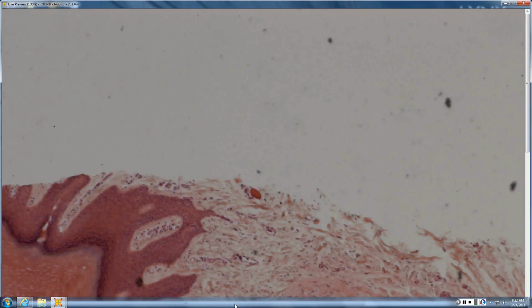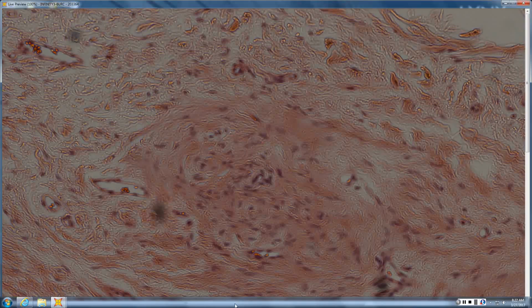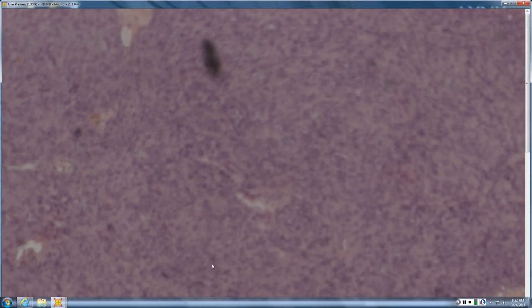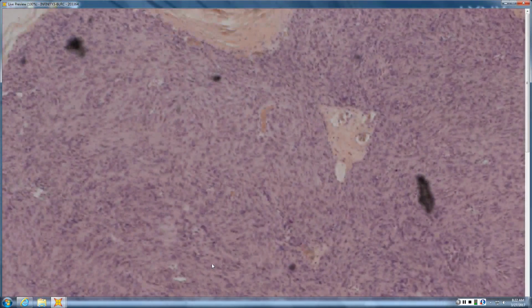So let's see, that's all we get is that piece there. Looks kind of acral. Looks kind of spindly. And I would assume that this was EMA positive and S100 negative. Then it's a perineurioma. Yeah, that's what they called it. It's a little less perineurial than some. Sometimes you go on the immunostains. This one was also called a perineurioma.